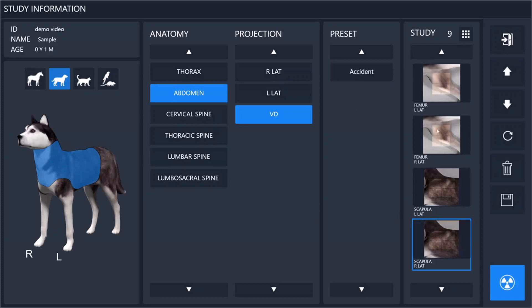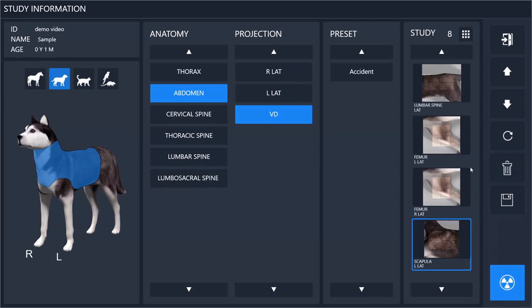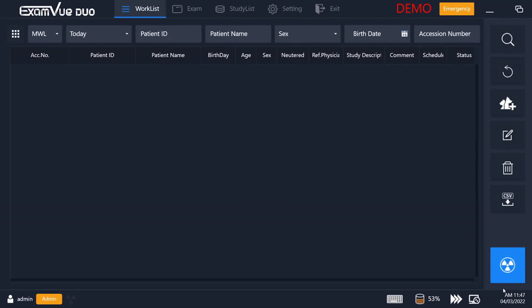You can see here it created two femurs and scapula views for an exam that somebody might have gotten into an accident. You can move them around and delete unwanted ones. You want to have all of your planned X-rays in the exact order you are planning to do them — that will make life easier for you when you click exam and start your actual X-rays.